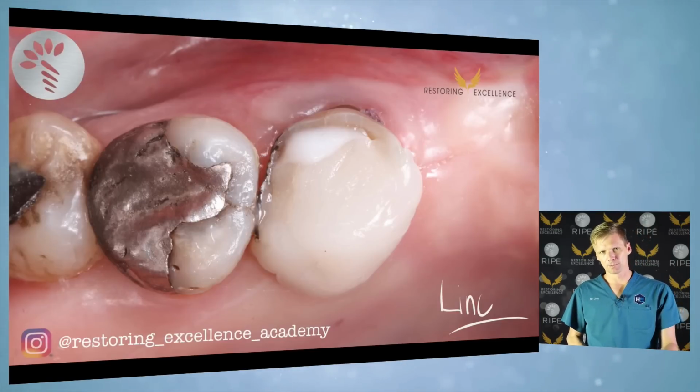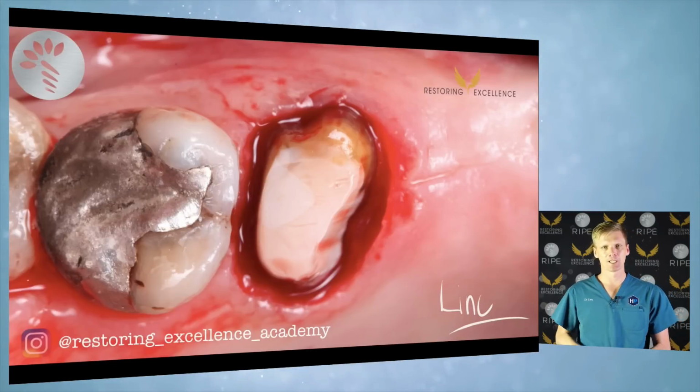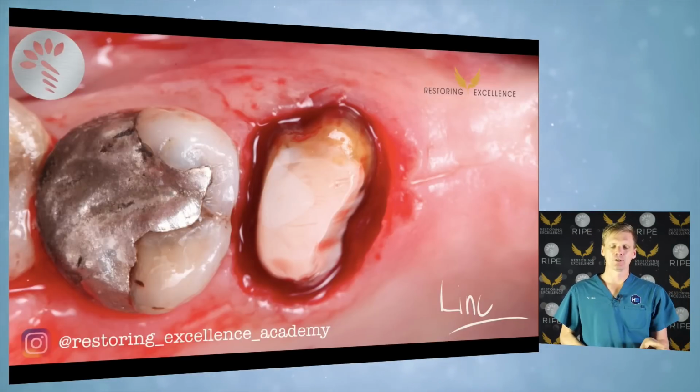And in this case, I'm doing a vertical preparation. So we know that it is going to be a bloodbath again. So it's the second time today for the same tooth. And how do we do that? Should we just put it?